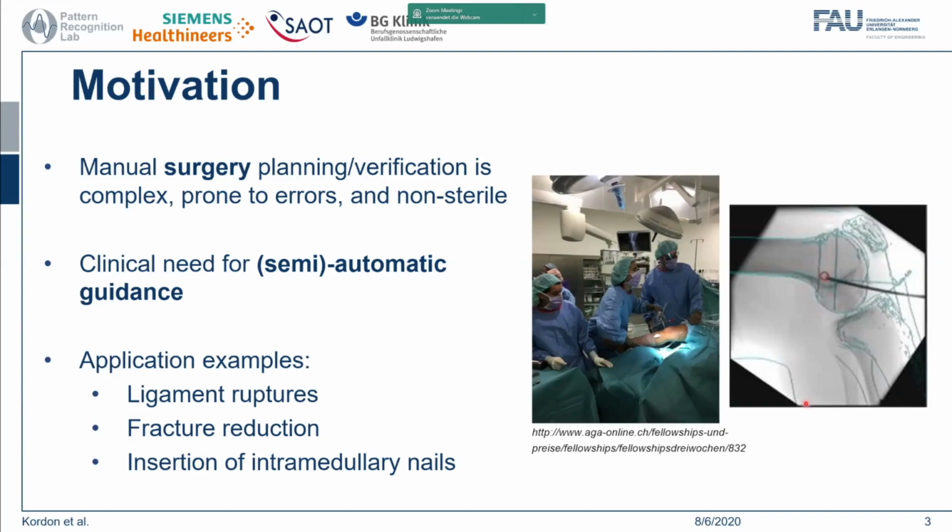So there is quite a huge need for some semi-automatic or even automatic guidance solution. Examples would be solutions to aid the surgeon when performing reconstructions of ruptured ligaments, or, for example, in the reduction of fractures, or if you insert some hardware to stabilize some anatomy, for example, intramedullary nails into bones.